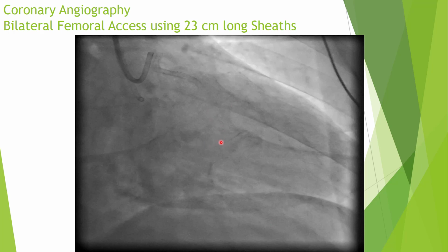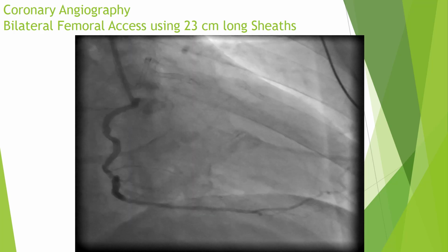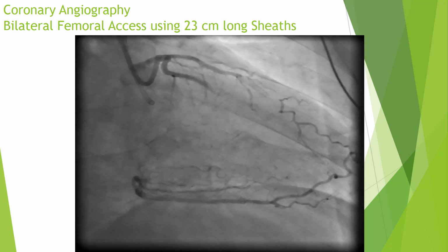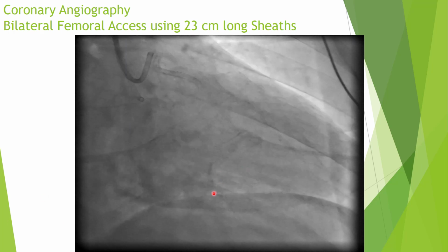It's running. So you see there's a new lesion in the distal RCA, which is moderate, somewhere here. And the circ stent is okay, no problem. So we went to the next step, just to show you more of it.